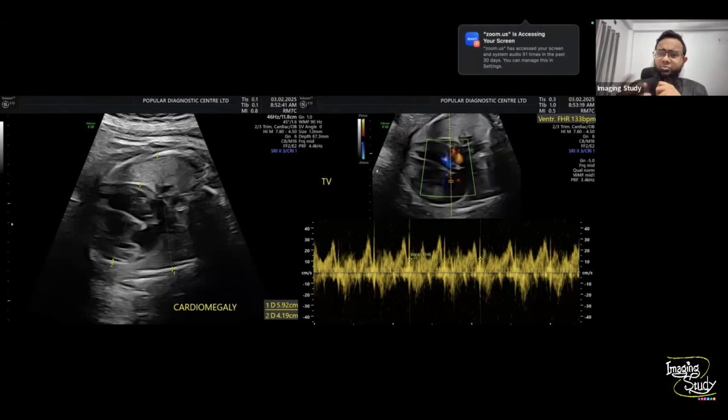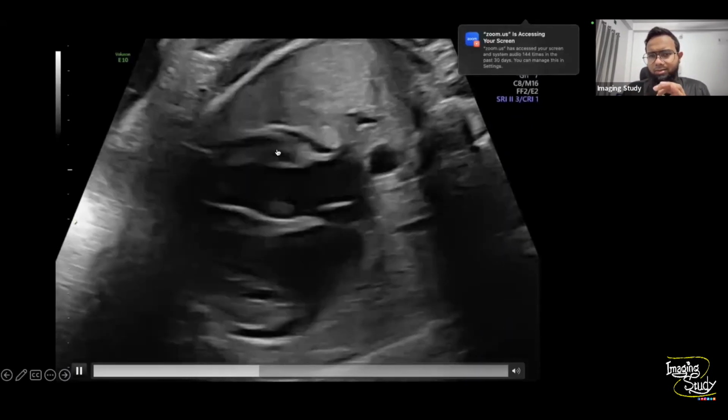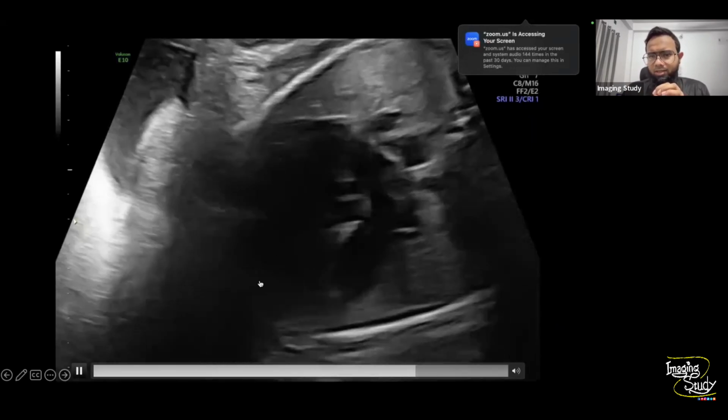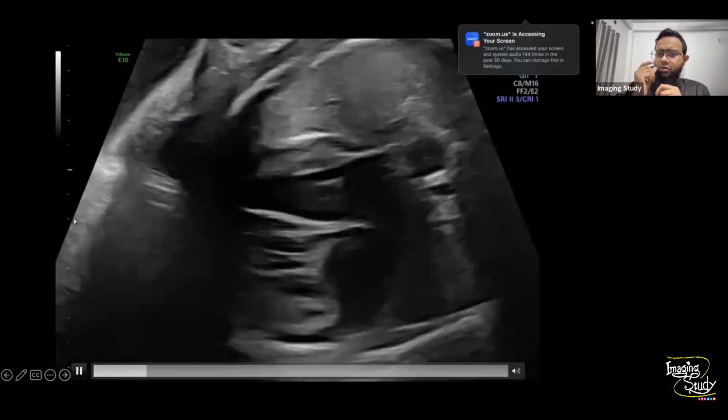So that's up to you how you want to measure. So we check the heart rate. It was normal and it was regular. There is nothing irregular, no irregular beats present. But if you look a little bit carefully, you should look at the ventricular walls. In this patient, the ventricular walls are quite prominent. So we think the heart is getting some thickening of the wall.